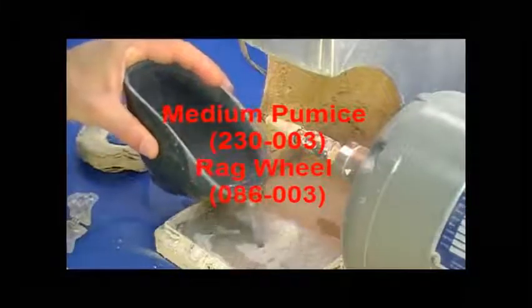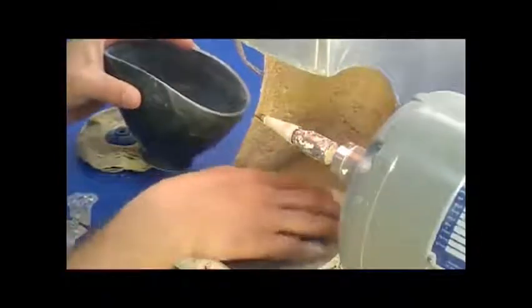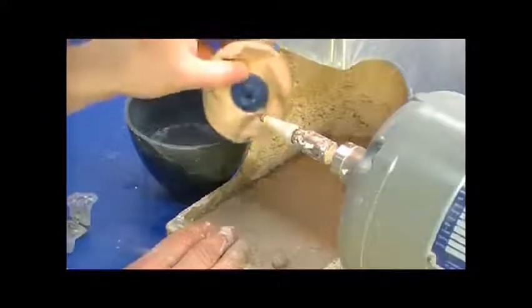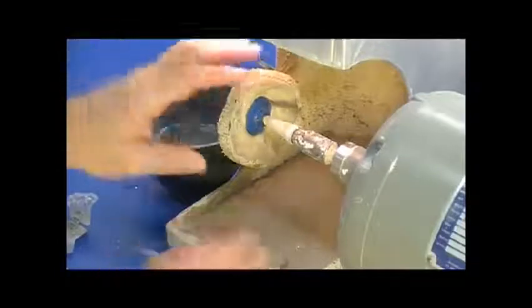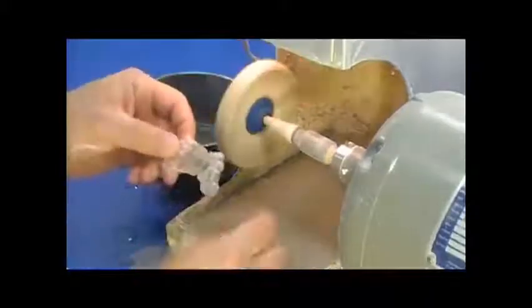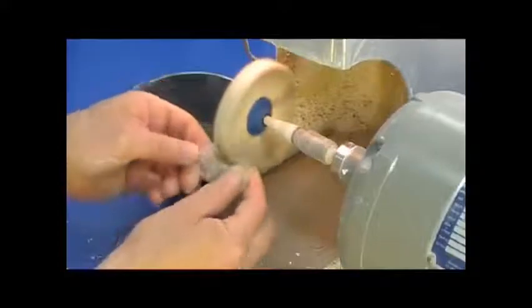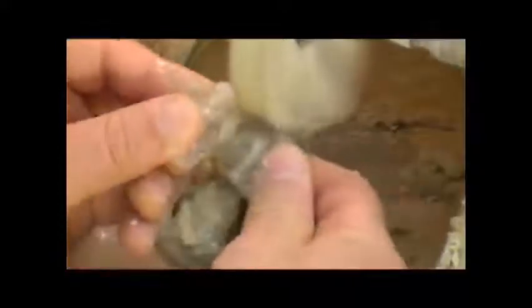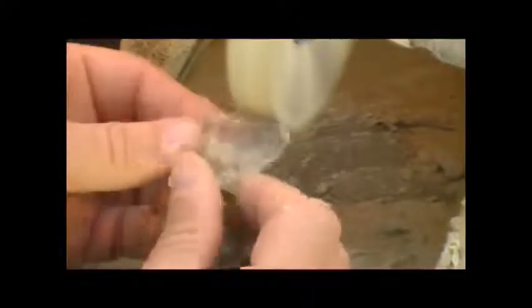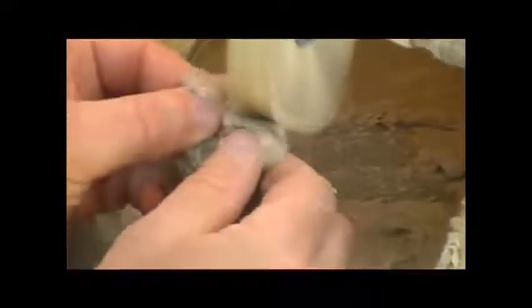A medium grade pumice is mixed with water to a mud pie consistency. Then a plastic center rag wheel is moistened and placed on the threaded mandrel using low lathe speed. Pumice is placed on the appliance and then pressed to wheel. Smooth trimmed acrylic using this technique. Once acrylic is smooth from the pumicing process, rinse and dry the appliance.